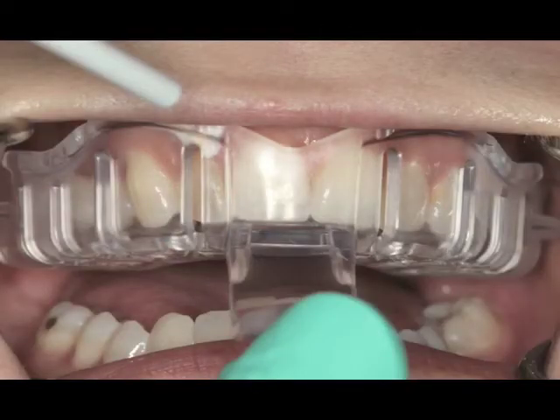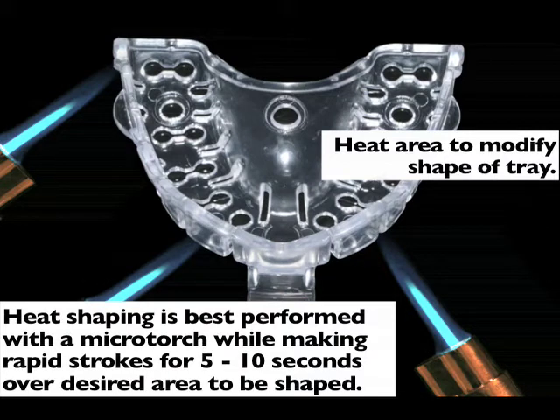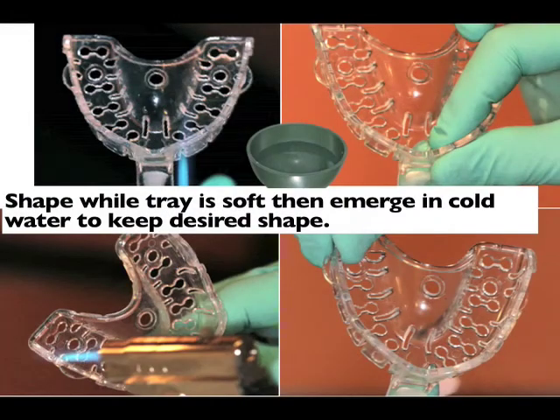The tray is placed in, making sure that we have enough tray on both the labial, buccal, and lingual aspects of the teeth. If you have any binding of the tray during placement, take a micro torch with very rapid strokes and go over the specific area that you'd like to reshape. If it's in the posterior segment, heat shape the posterior area and then bend it outward. There's a pre-maxillary anterior bend and a posterior bend outward to make the tray fit the existing dentate arch.